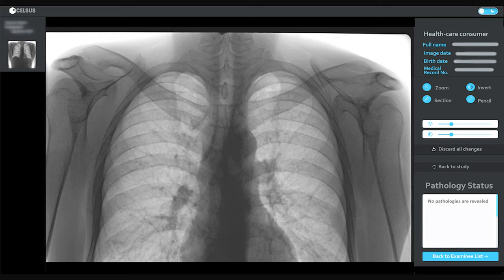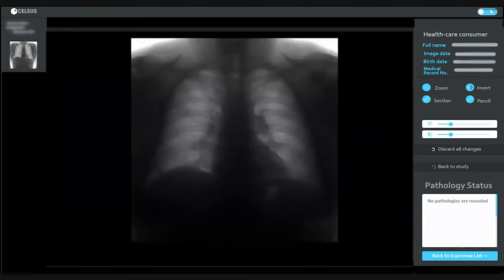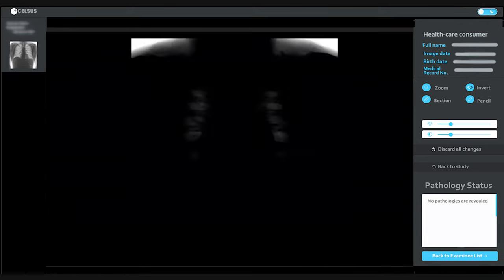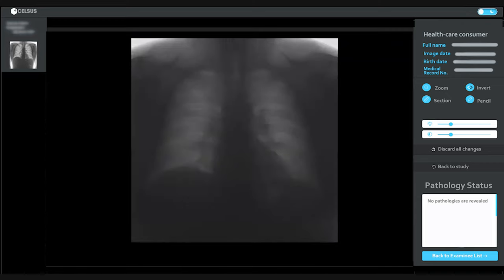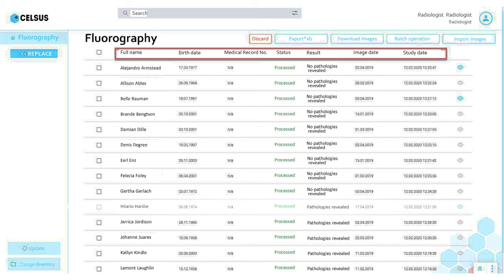Celsus also allows the doctor to go to a detailed study of the research by clicking 'More Details'. In this block we can use various built-in functions such as inversion, brightness adjustment, and contrast. Celsus integrates into the usual ecosystem of a radiologist, which allows using the service without any coordinated revision of the usual processes.